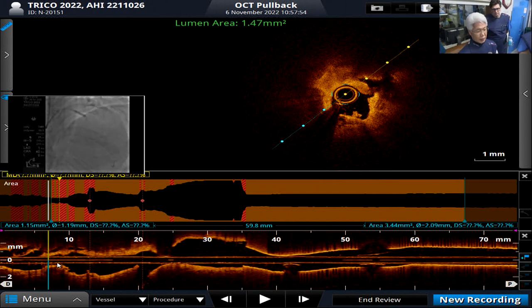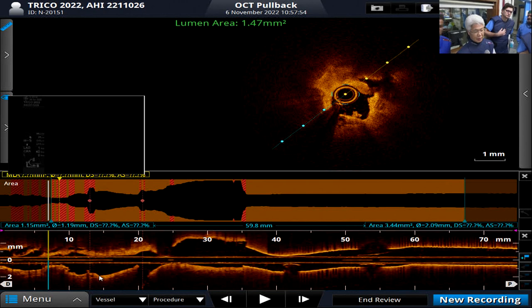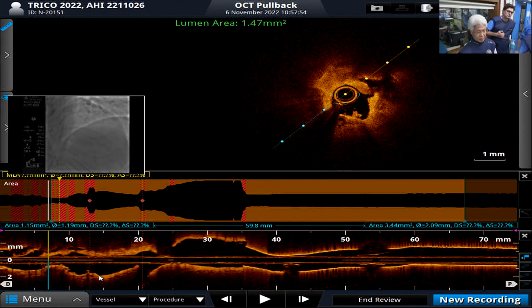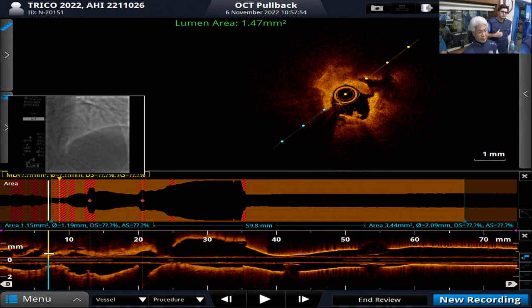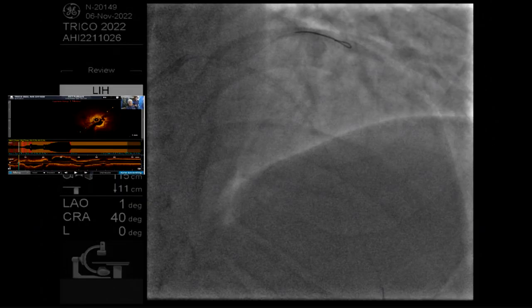You move on. Yes, we have to make a scoring, right? If the thickness is more than 500 micron and the angle is more than... I mean, the data show that it's 0.443 millimeters of calcium. So 443 microns of calcium will respond well to a cutting or scoring balloon. Very high pressures are for 670 microns. Below 670 microns, it's sort of unclear whether it's cutter or whether it's high pressure. Beyond that, you're looking at atherectomy or shockwave lithotripsy.